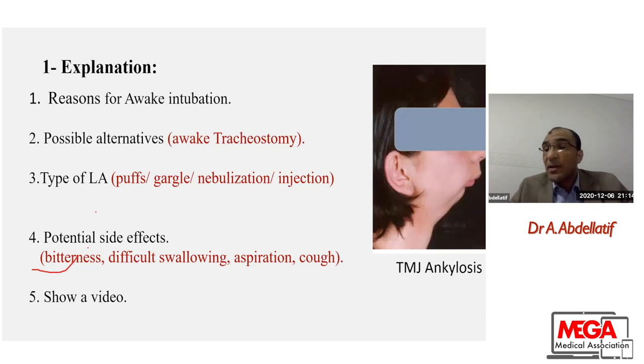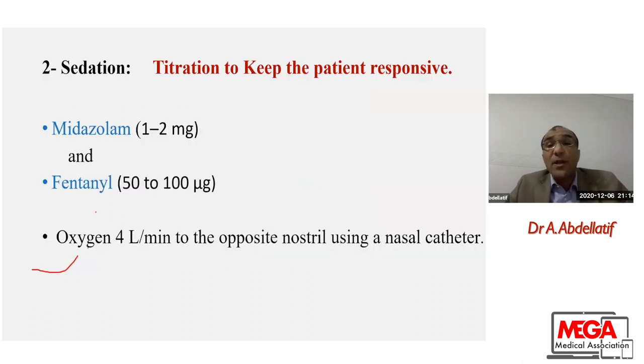And sometimes I show him an illustrative video. Sometimes I tell the patient that this procedure may be done in some ENT clinics, like nasoscopy, or when the ENT surgeon wants to see the vocal folds. So this is half of a procedure that can be done in a clinic. Sedation titration is very important to keep the patient responsive all the time, like midazolam and fentanyl, and I have to consider the administration of oxygen through the other nostril if I'm going nasal, or nasal cannula if I will go oral.